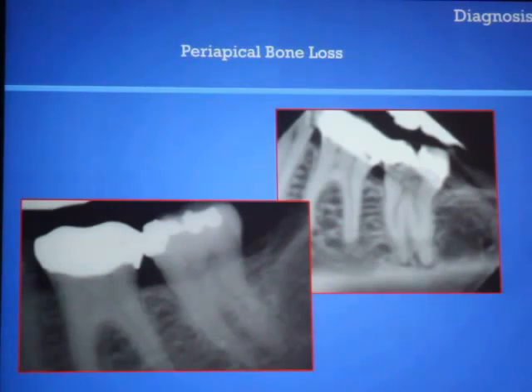This avoids unnecessary trial and error treatment, and it tells us the diagnosis in 15 minutes. We can do the right treatment, and appropriate management can be provided using this conebeam CT here.